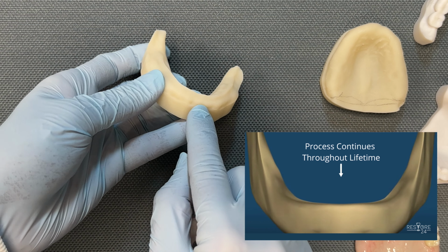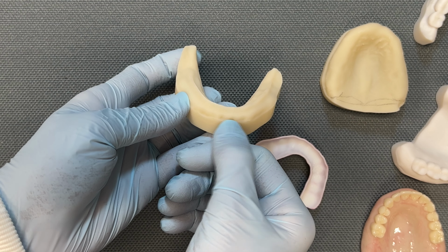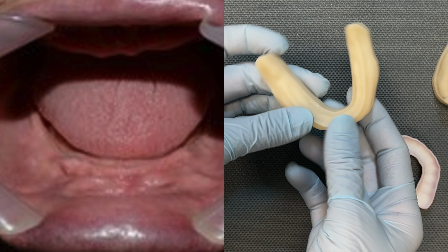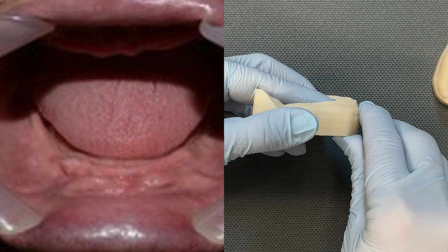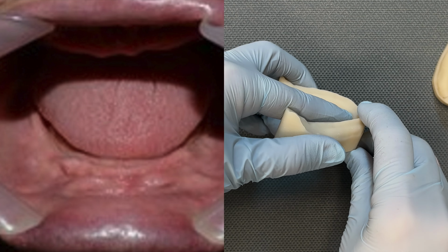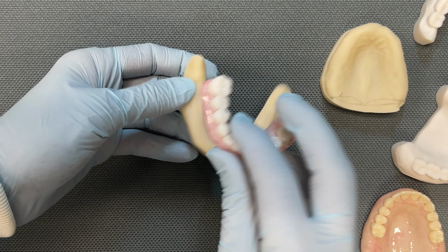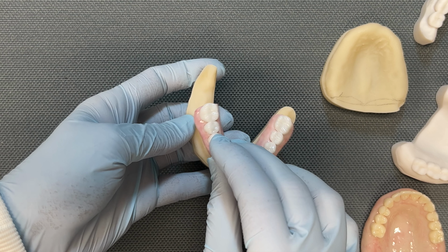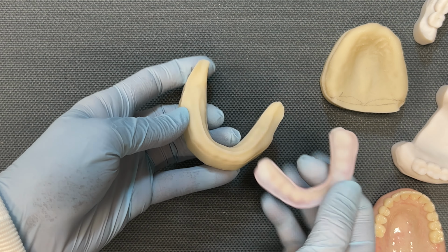I mean, if you saw what this looked like in the mouth, if you can imagine your lip is here, if you pull it out, and then back here is the floor of the mouth. So when you look in the mouth, you've got nothing for it to sit on but this little knife edge ridge, and there's nothing to hold on to it. So you basically have this lower denture that's been relined to where it's basically flat. It may have this little groove from where this ridge line is here, but then you're going to have what we call a floating denture. I mean, it's just going to be sitting down every time your lip or your tongue moves or you try to talk. There's not going to be any support for it.